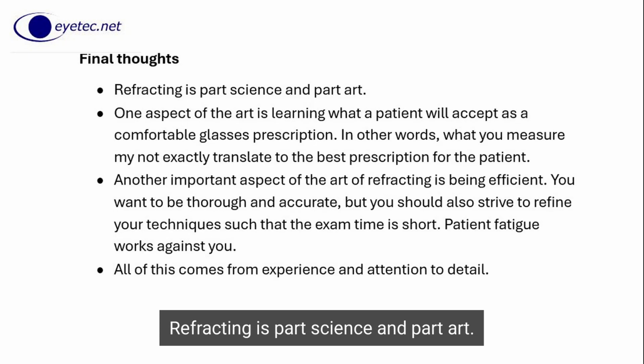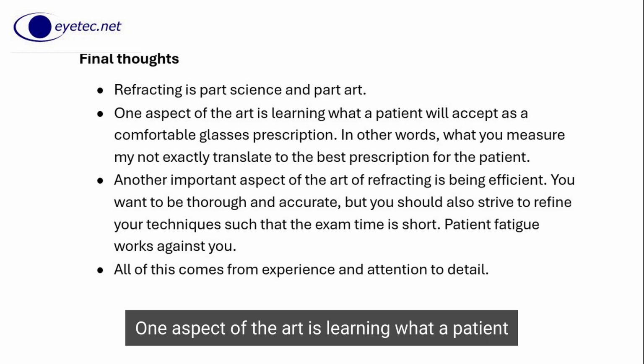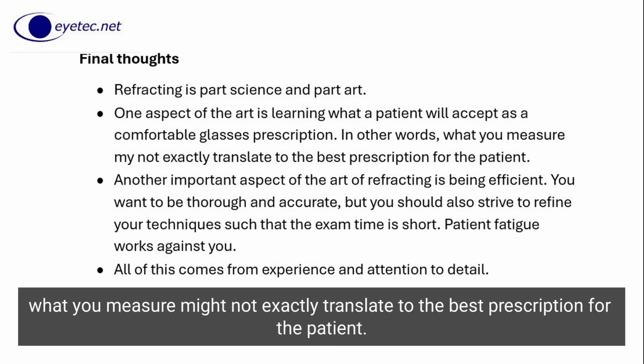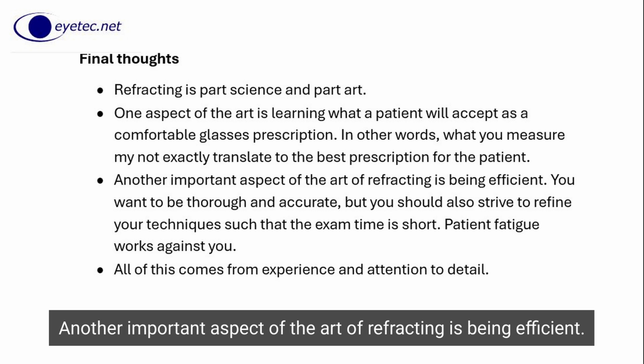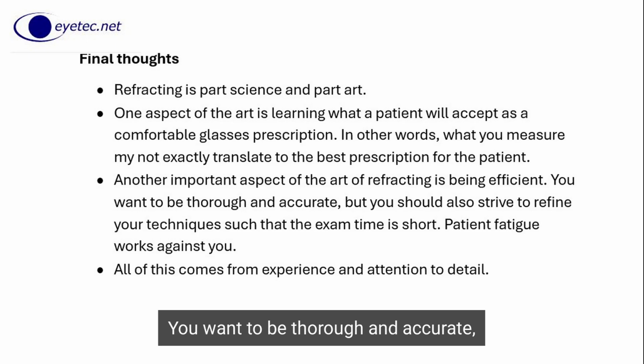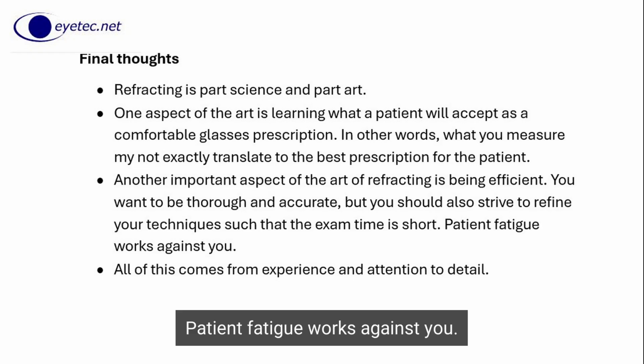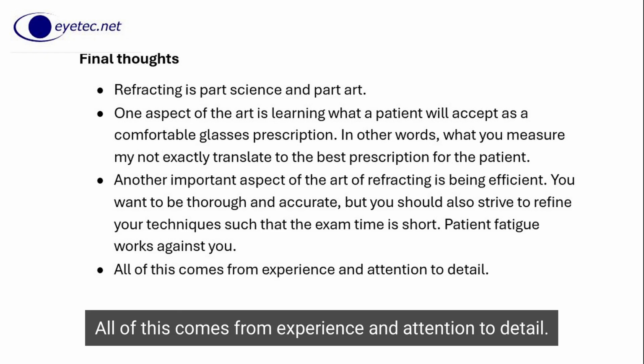Refracting is part science and part art. One aspect of the art is learning what a patient will accept as a comfortable glasses prescription. In other words, what you measure might not exactly translate to the best prescription for the patient. Another important aspect of the art of refracting is being efficient. You want to be thorough and accurate, but you should also strive to refine your techniques such that the exam time is short. Patient fatigue works against you. All of this comes from experience and attention to detail.